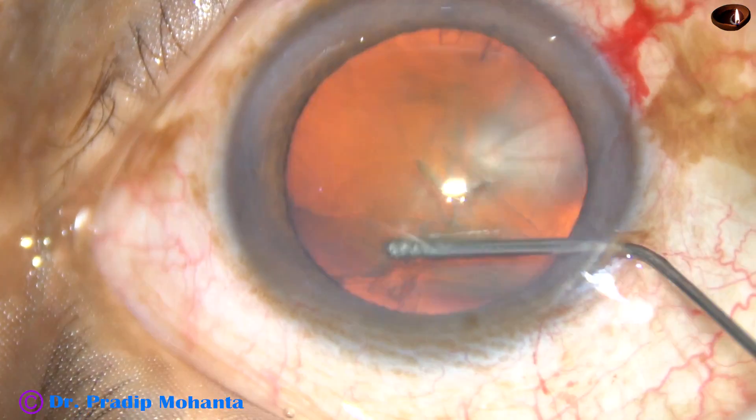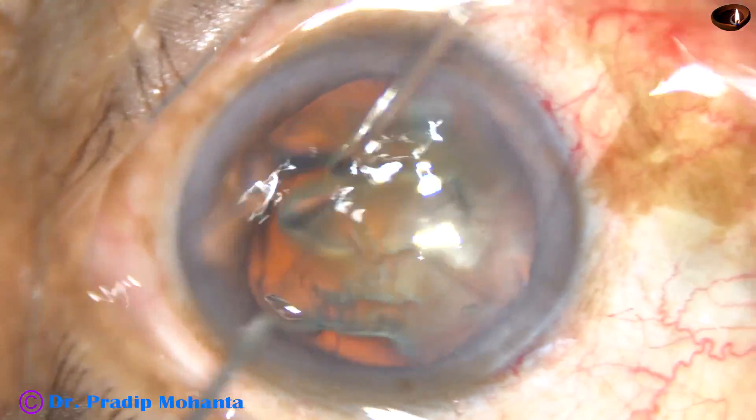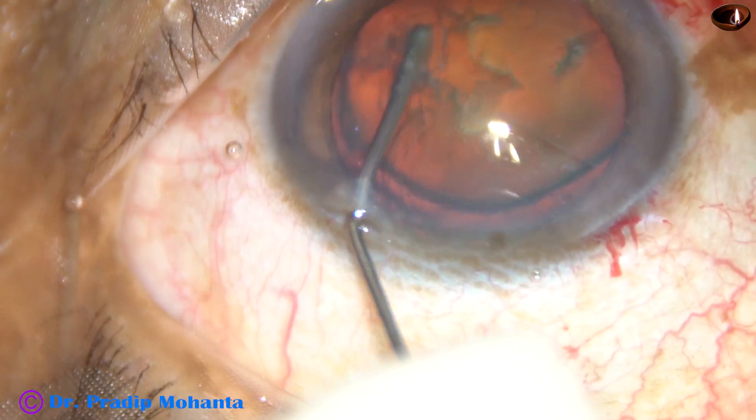Hydrodissection. The fluid wave goes to the opposite equator. The nucleus is ballotted. And the nucleus is mobilized and rotated.